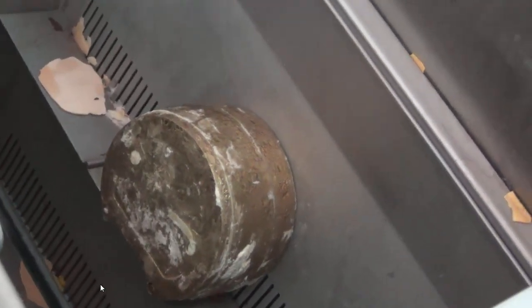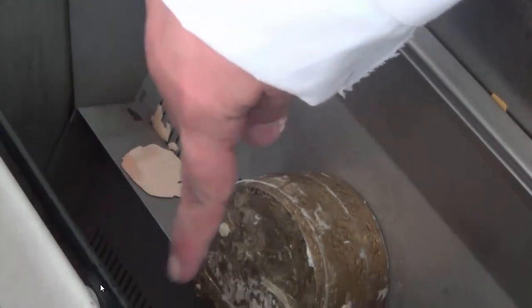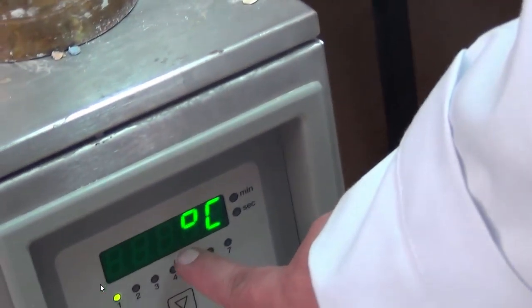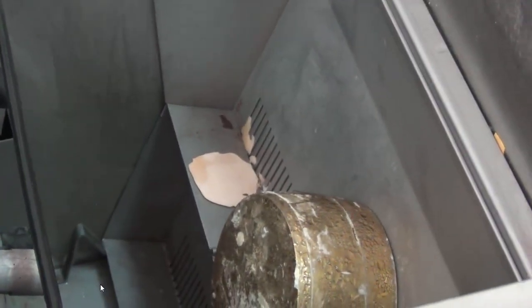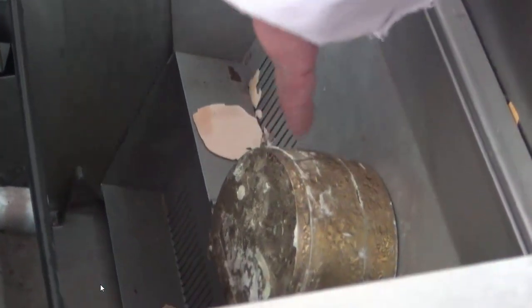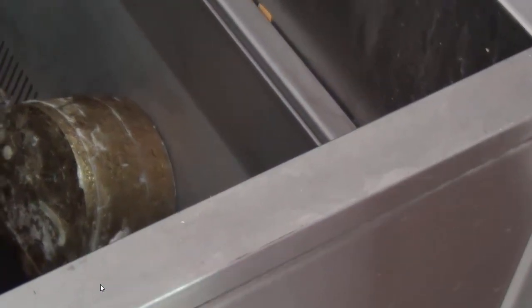We're not going to run it because we want the sound clear on the video, the demo, but we put it inside here and we run a spray. So there will be a hot spray of water running over here for 10 minutes. The temperature is around 85 degrees when it runs. Once this is soaked in the heat for 10 minutes, that means the layers of the wax inside are no longer solid. They are soft, and they allow us to open the flask.